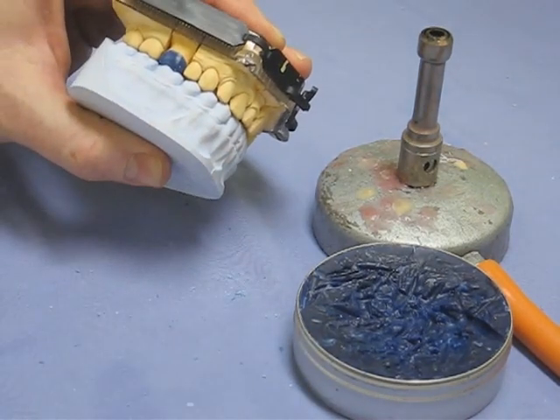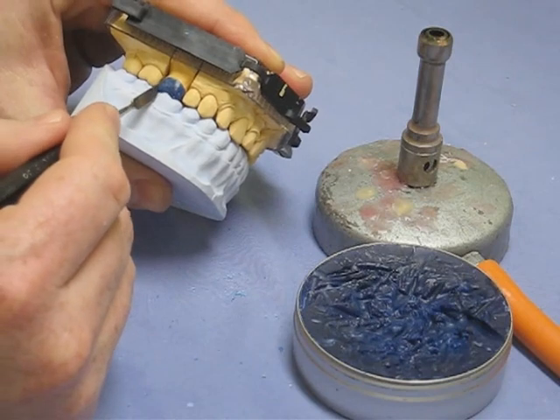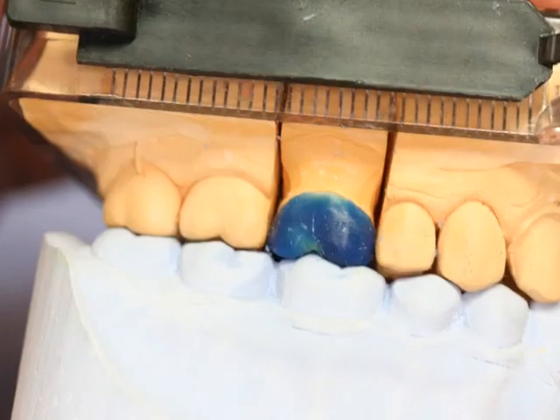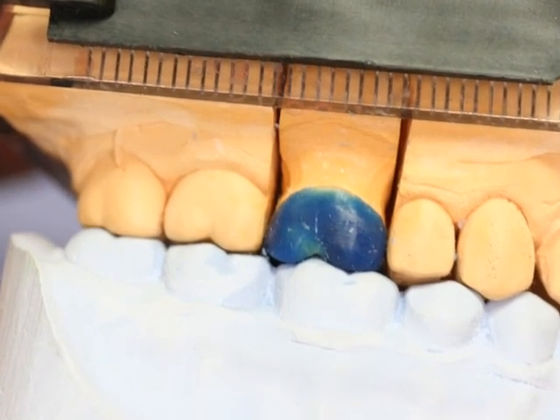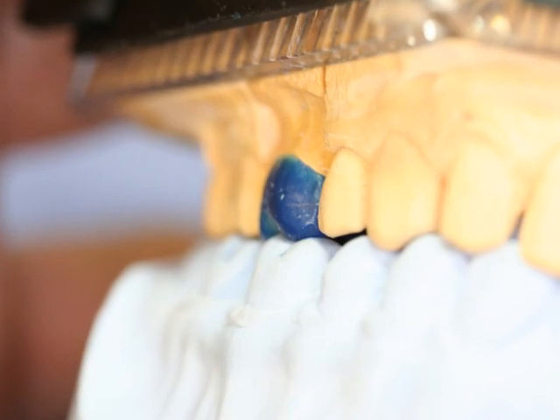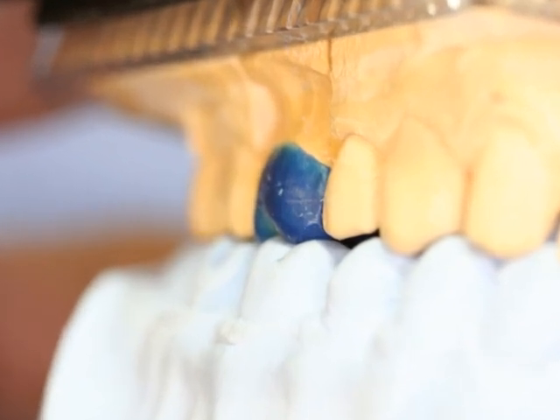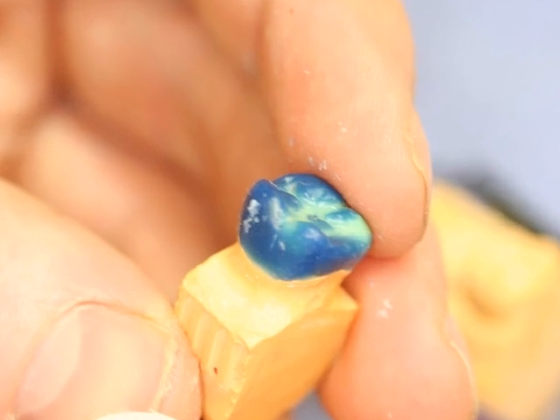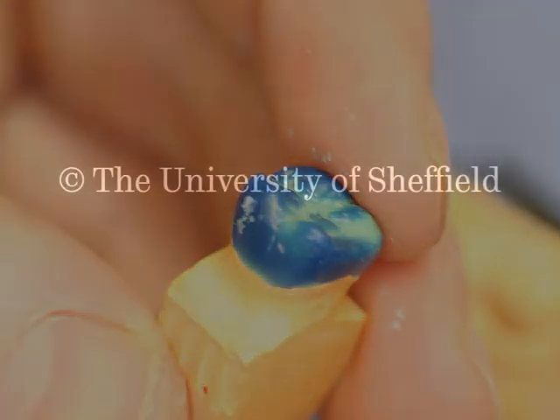Checking contacts with the opposing model, just pointing out where it might be improved a little bit on the distal — but it's not bad, nice profile. And checking the occlusion — that's the finished article. Job done.